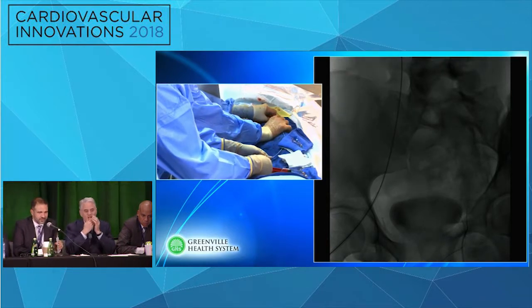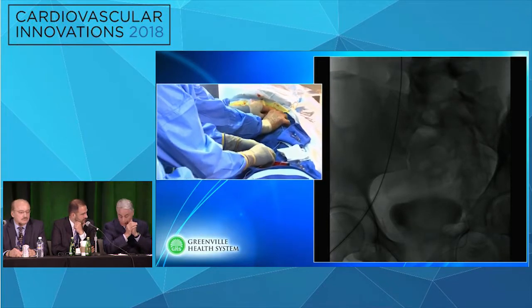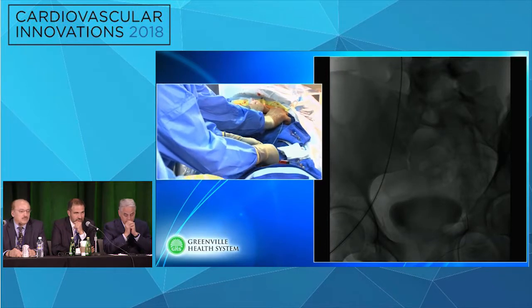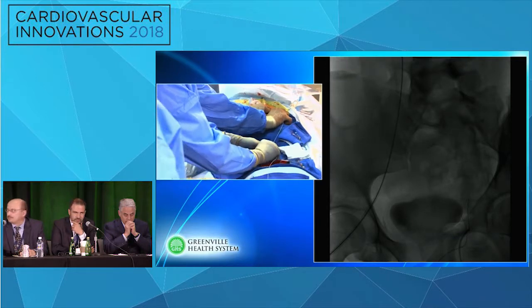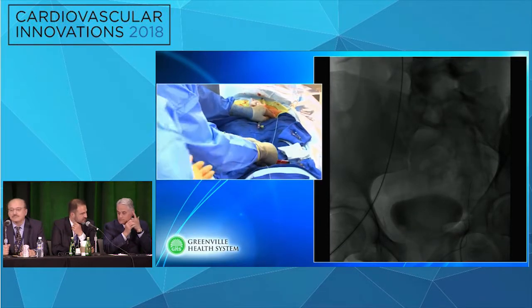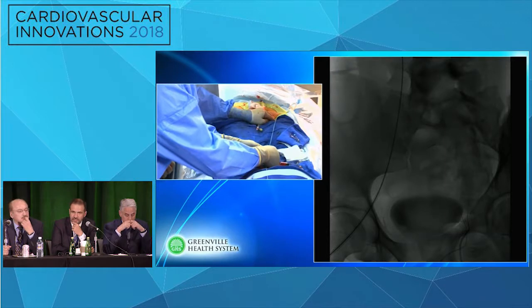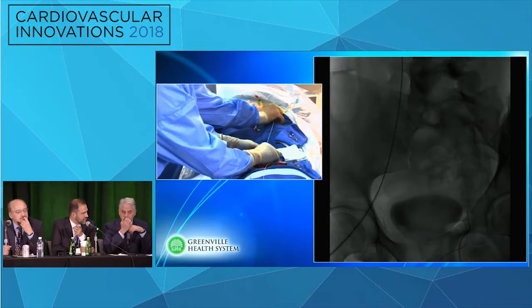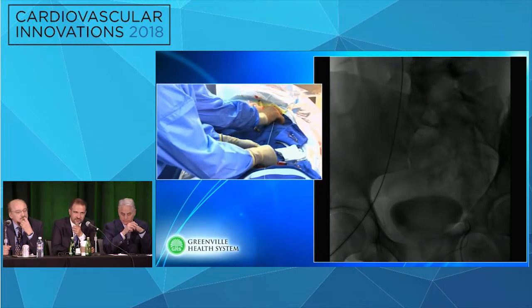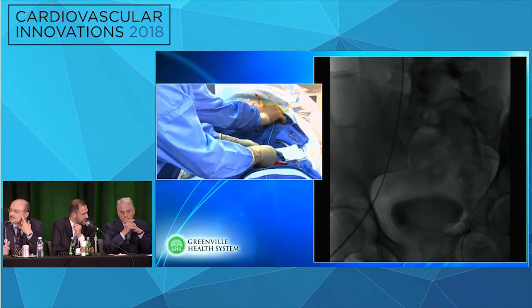I don't want to jump the gun, but the other challenge is that when you're deploying those stents from the neck, it's much harder to control them, and they move a lot. So you could end up either not catching the May-Thurner, meaning falling short of the bifurcation, or extending extensively into the inferior vena cava and covering the other side. There was actually a recent paper that showed there is an increased rate of contralateral DVT in patients that have been treated for May-Thurner, and the authors thought that the reason for this is the lack of careful placement of these stents at the bifurcation, meaning that we are jailing the contralateral limb.